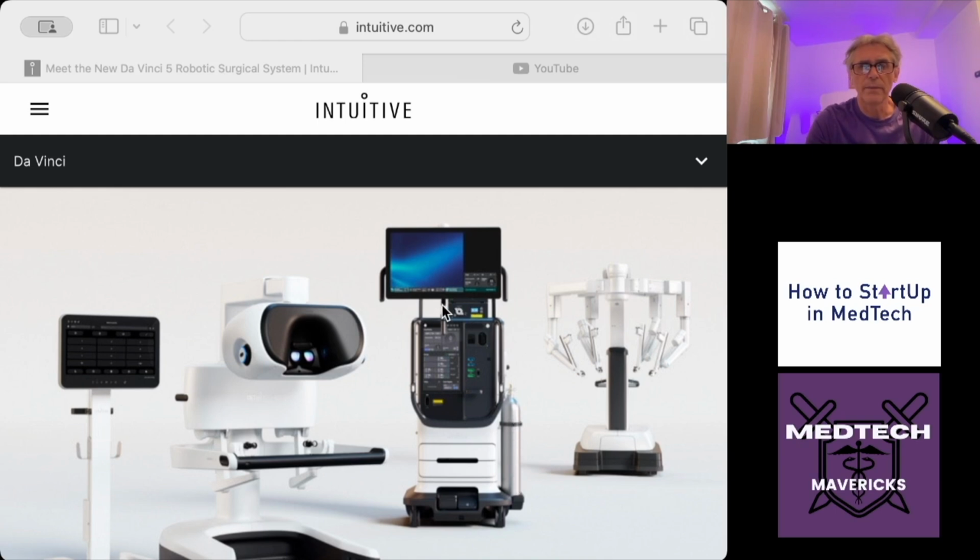Now up here as well, I pointed this out in my first video and I will double down on this. So this is a fully capable handheld laparoscopic camera with near infrared ICG capability. Whatever anybody tells you, it's not just for primary entry, it's also for laparoscopic. And in the meantime, what I've heard on the grapevine is that several hospitals have bought the systems and they've been told, if you use this for a laparoscopic surgery case and don't use the console and the robot, you don't get charged on your pay-per-click model. So I think that's really important.